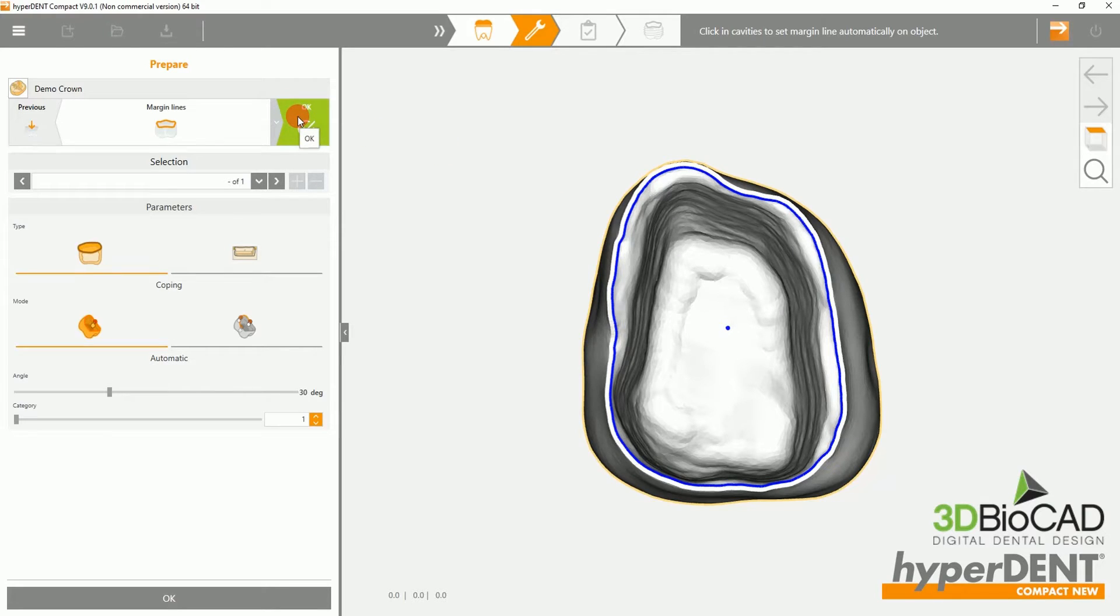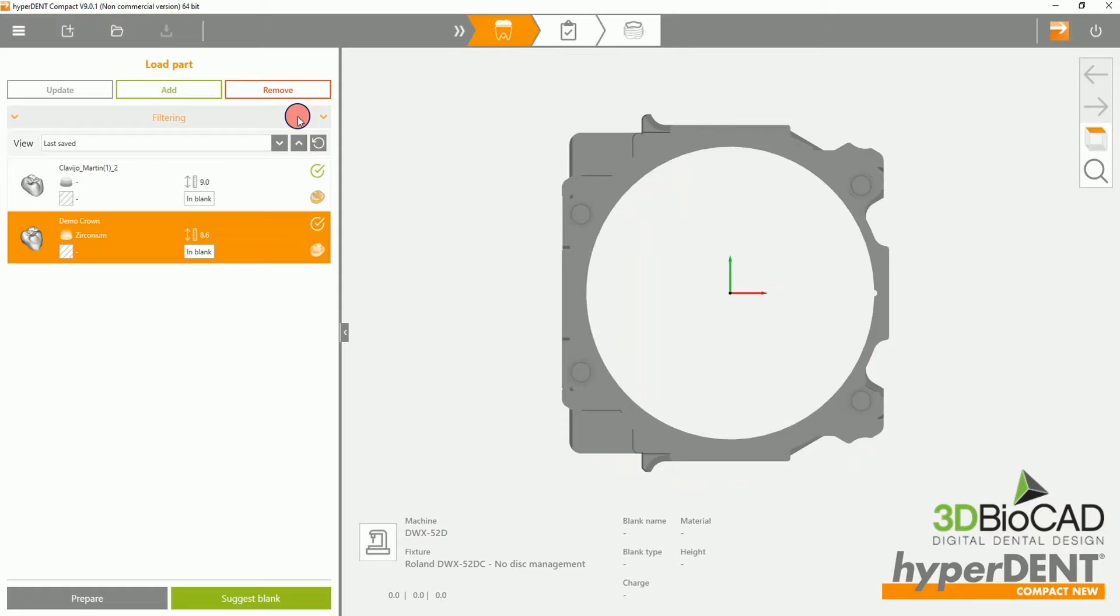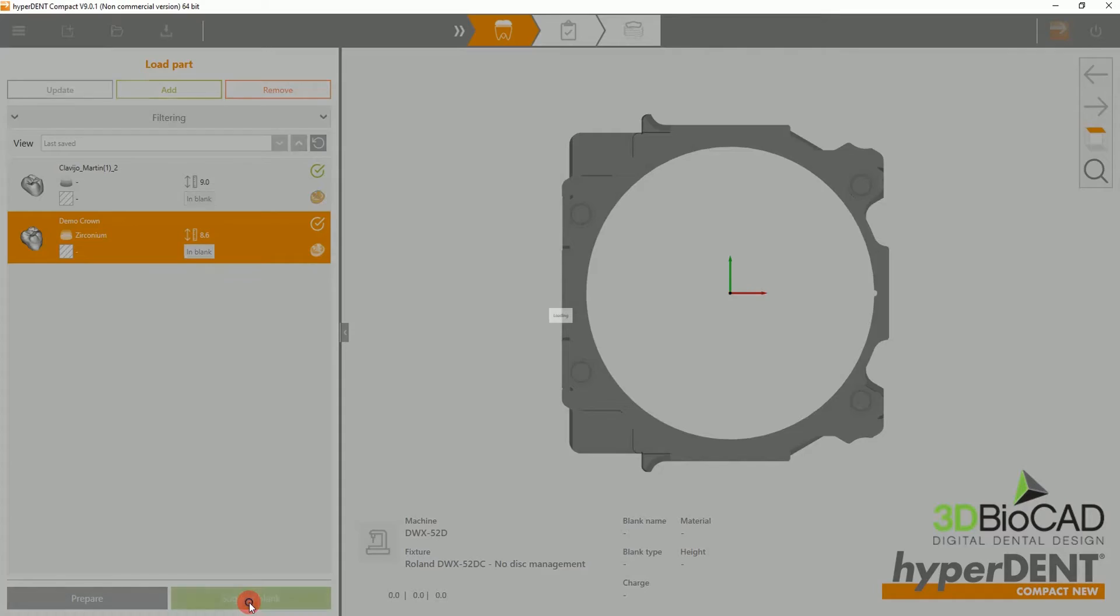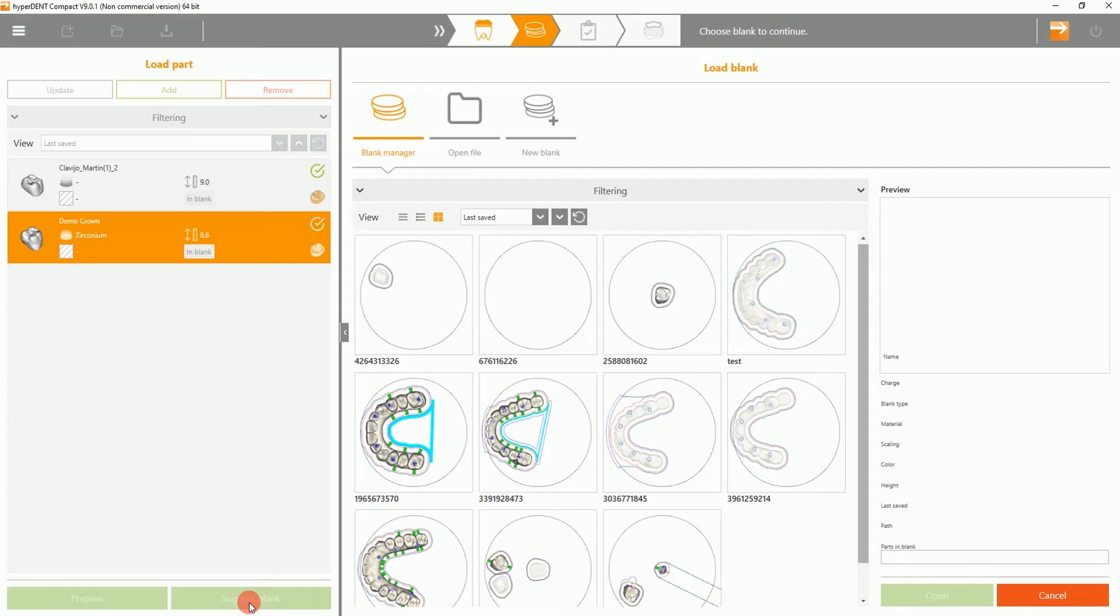Please select Next so we can load a blank. In this case, we will be using a new blank.